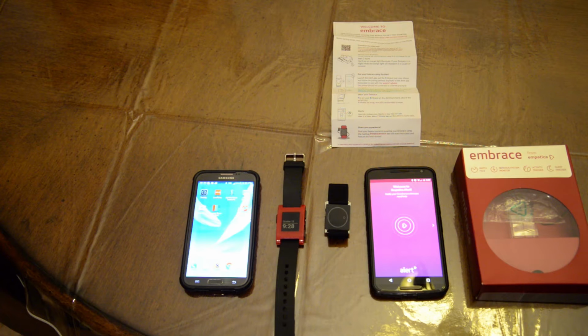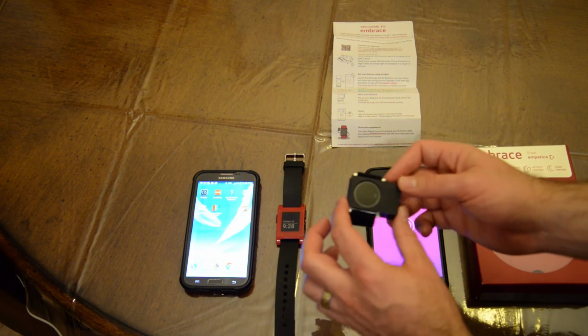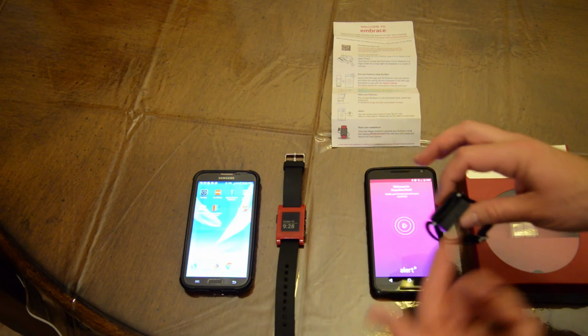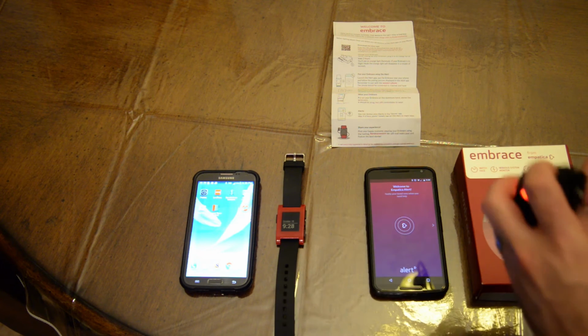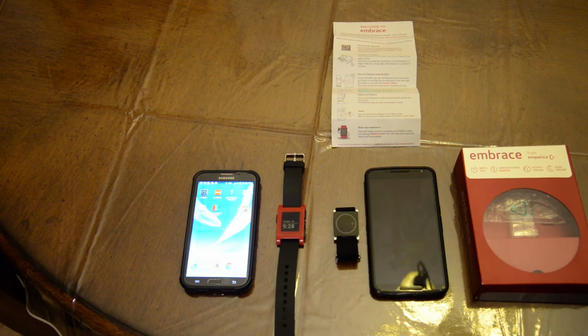In order to charge your Embrace, you would want to match the heart with the heart that's etched in on the watch itself. It's simple. You plug it in like this, and then you plug this into any standard phone charger with a USB connection. It uses the same charging port as Android phones. It won't be compatible with your Apple phone chargers, but in fact, it comes with its own USB, so you'll be able to connect it to any charger that has a USB connection.